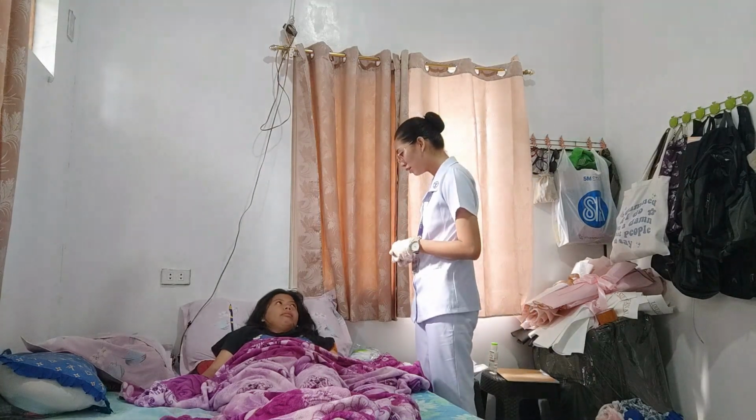Yes. Okay. After that, we must assist the patient to a position in which the arm, the leg, or abdomen can be relaxed depending on the site to be used. Ma'am, are you comfortable in that position? Okay. Now we're going to determine which site will be used and expose the potential injection site.